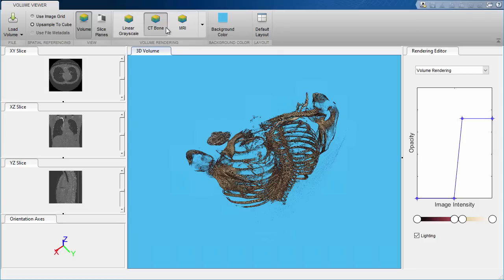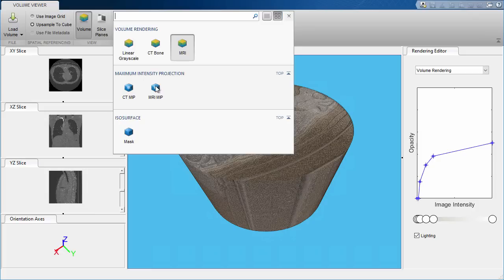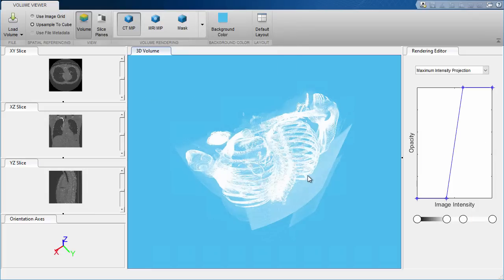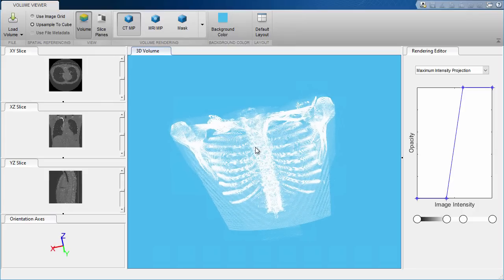You can start by trying some of these preset configurations. These are simply suggestions for values that typically work well for this type of data — MRI, CT bone scan, etc.